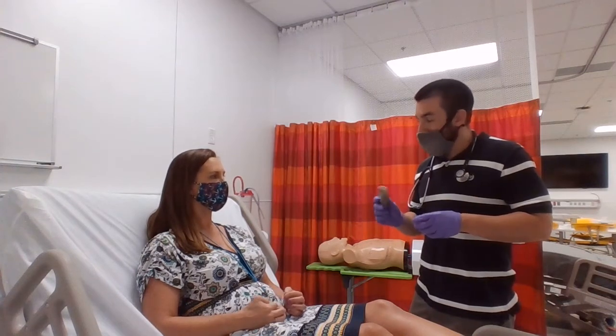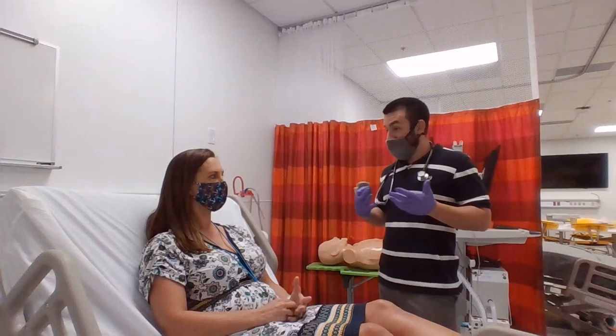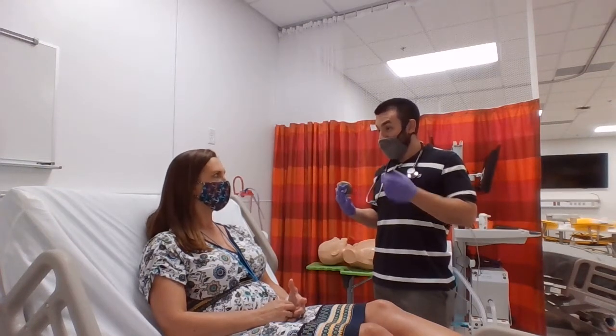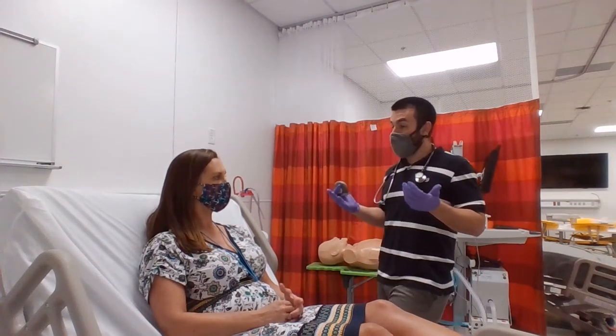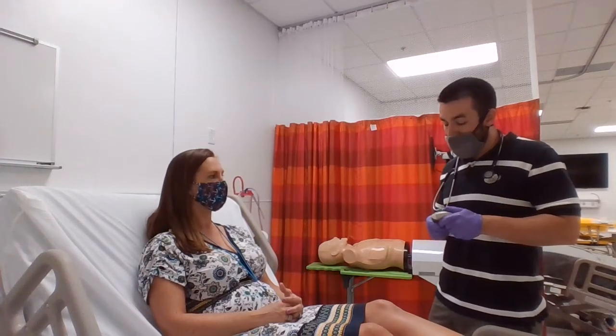What I have here for you is a drug called Advair. Really, it's two drugs mixed together. It's another long-acting bronchodilator to keep you opened up throughout the day, and it's an inhaled steroid to keep that inflammation down in your lungs and hopefully keep that breathing doing a little bit better.